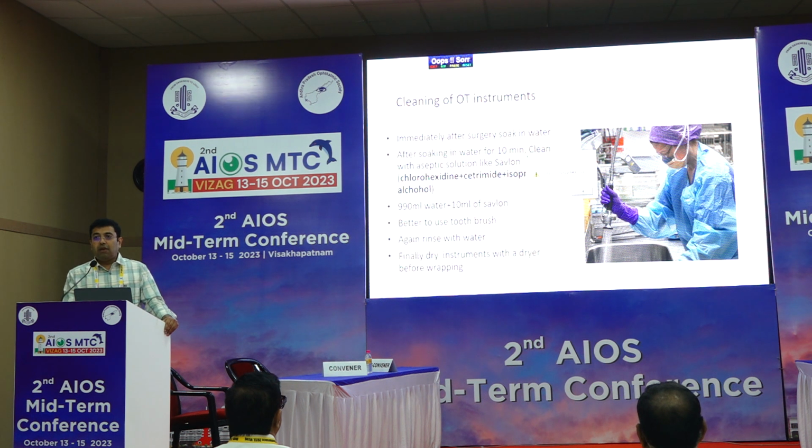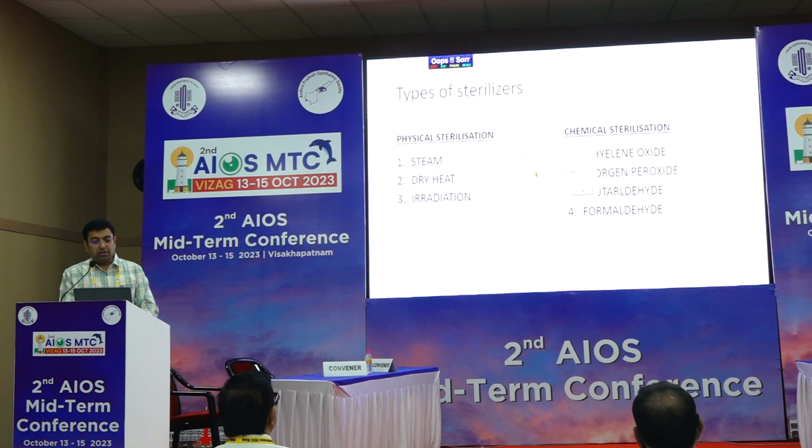And finally, after Savlon, you have to again rinse with water, and finally after rinsing with water, dry all the instruments. It is preferable to use a dryer, before wrapping all the instruments.